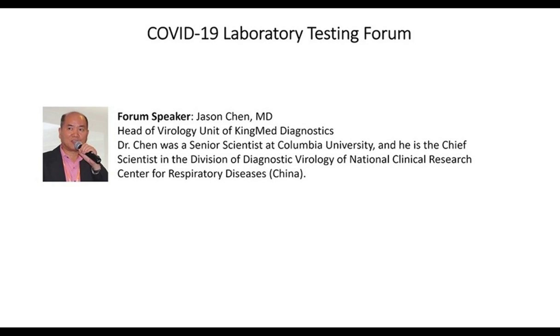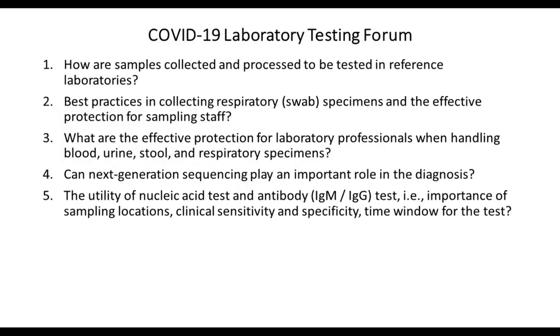Thank you, Dr. Chan. I have a follow-up question. You mentioned that you have used the chemiluminescence assay, which can be either quantitative or qualitative, and you also mentioned the colloidal gold test, which is more like the lateral flow point of care testing, just yes or no. So, do you see particular usefulness of measuring quantitative results using chemiluminescence assay?